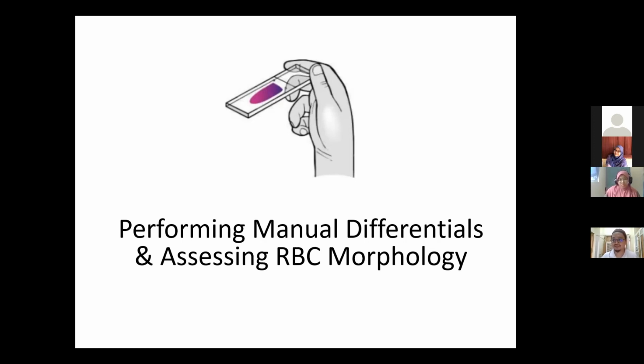And this Romanowsky stain has its do's and don'ts, so you need to view. If you get nice staining, it is good. If you have too acidic or too alkaline staining, you have to look back at your stain and your method, and change accordingly. Now, once we have stained, it is time for us to view.